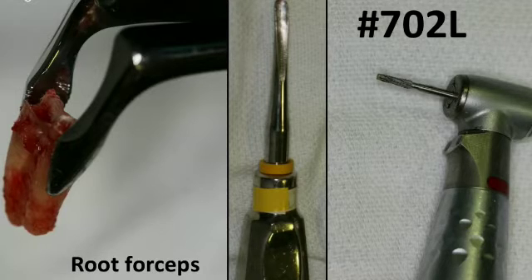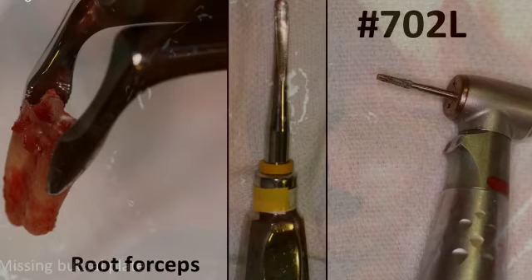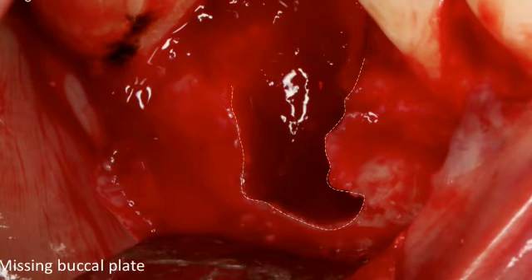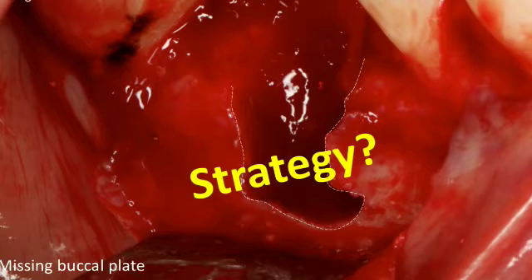All of this is explained in the book. Once you look at the buccal plate, pretty much what we thought was happening is confirmed — there's a very significant defect in the buccal plate, with no bridge of bone. A full-thickness flap has been reflected, making it easy to debride. I can protect the soft tissue with an elevator and make sure this defect is very clean. This is a pretty extensive defect.